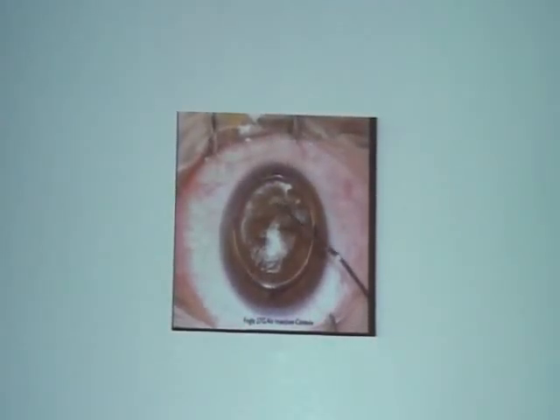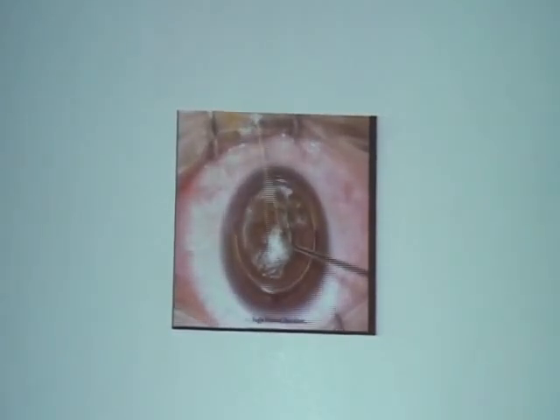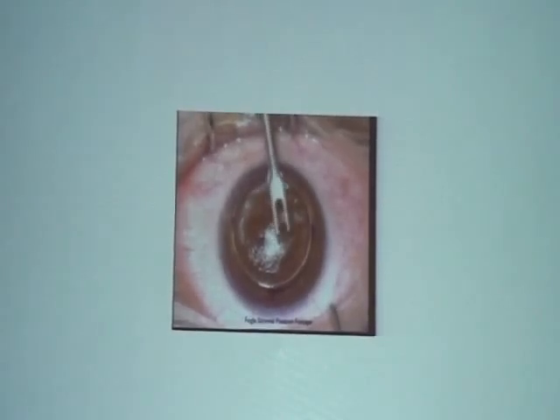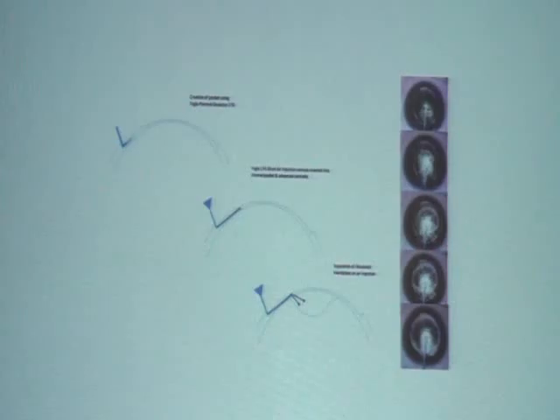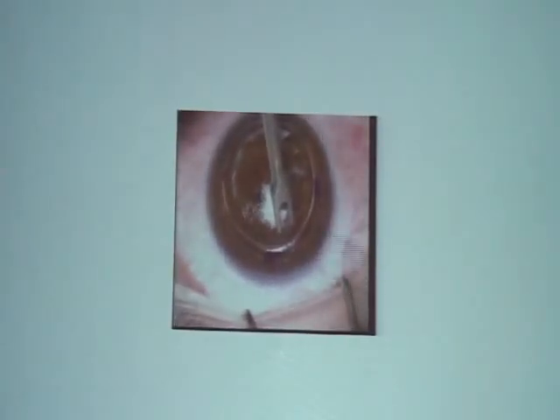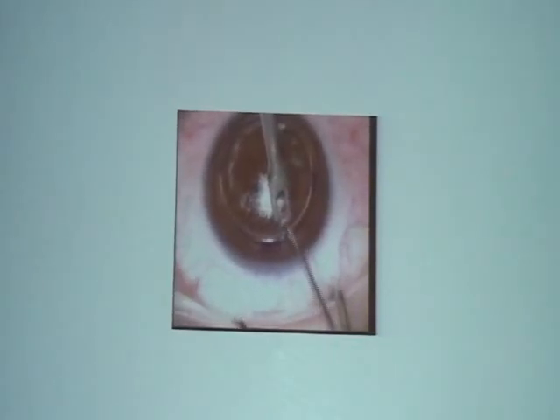So that's the air injection cannula, which is the bottom port cannula. That's the pointed dissector with which you make a small pocket into which you put the cannula. And that's a stromal fixation forceps that helps you stabilize the peripheral edge of the corneal tissue once you make the pocket. So if we see, we have already done the anterior lamellar keratectomy. You go to the periphery, you have a small ridge. You grasp it with the stromal fixation forceps, go with your pointed dissector to the base of the cut, and then make a small pocket only about a millimeter and a half.